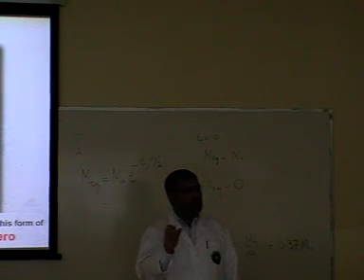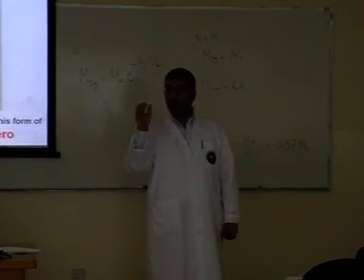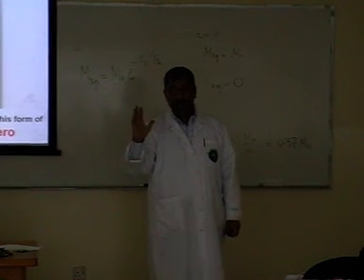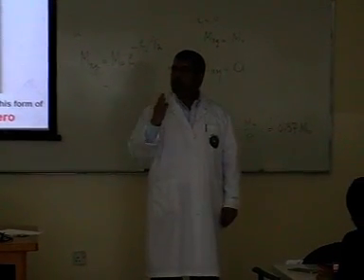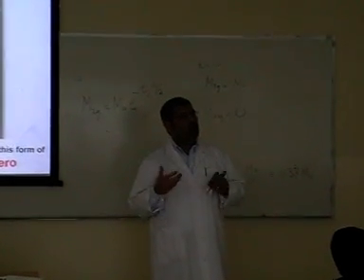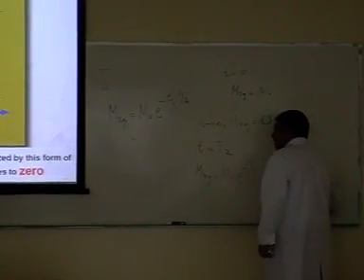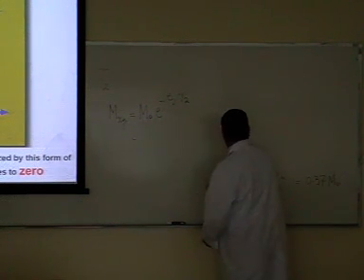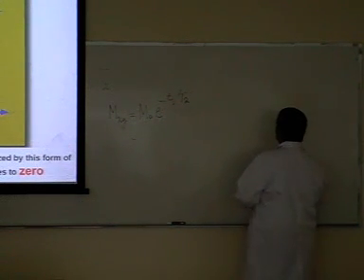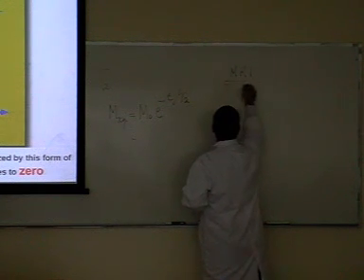In the second part, we applied the RF signal, the radio frequency, which is an electromagnetic signal, and we saw what that gave us. We've done a lot of what we need to do in MRI.